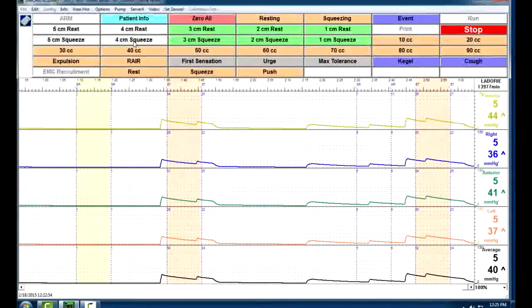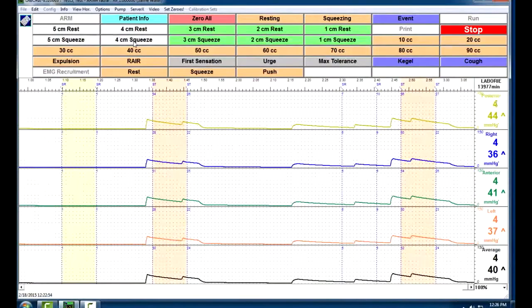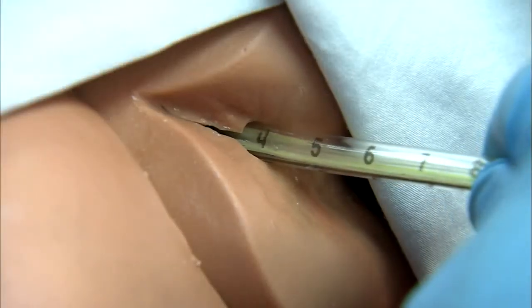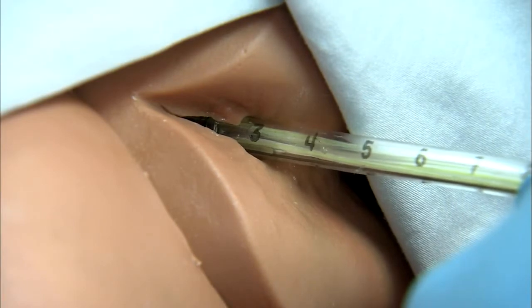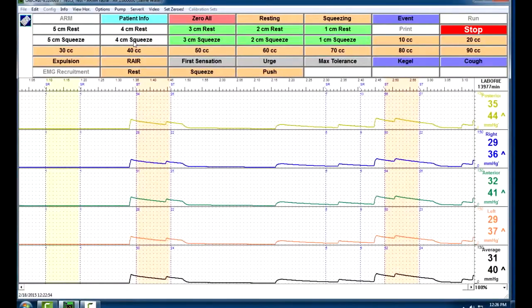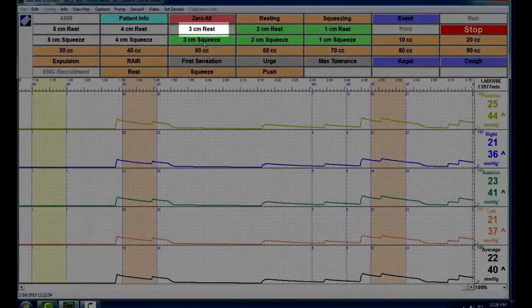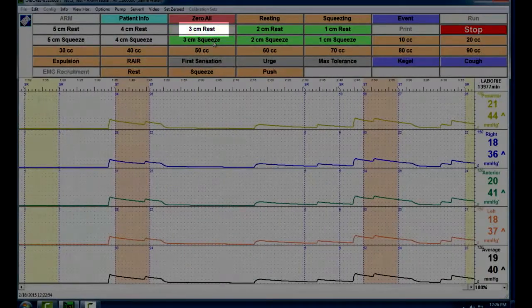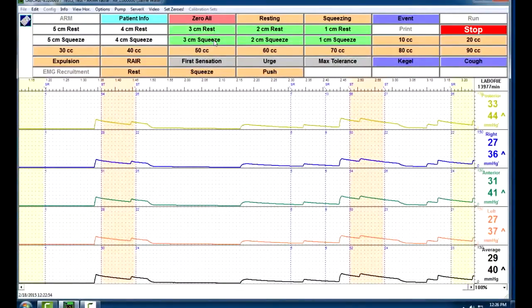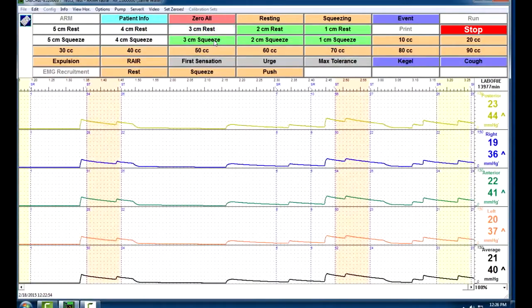Go ahead and let them relax, and they can bear down a little bit. Have them push again to sort of reset their pelvic floor. At this point, we're going to pull it out to about the 3 centimeter mark. We'll have the 3 centimeters right at the anal verge. The pressure should be a little bit higher. And again, now we're going to have them rest. Go ahead and just have them rest quietly there while they're measuring those pressures. Then the 10 seconds is up.